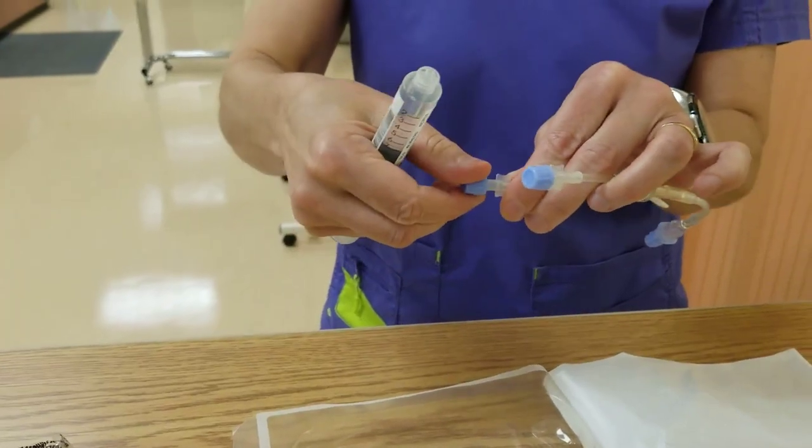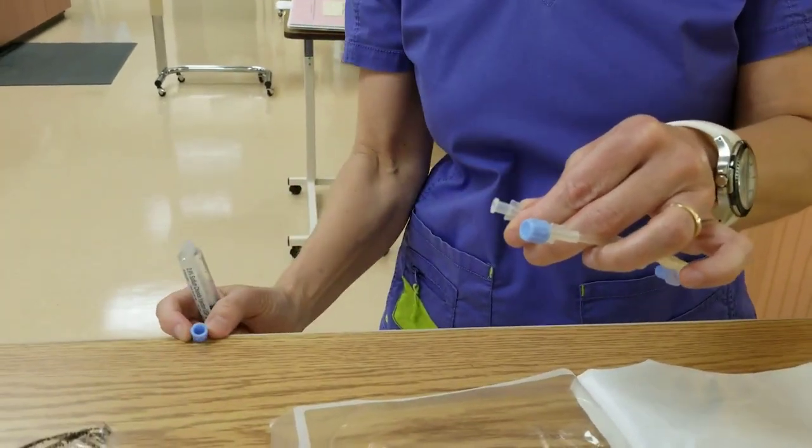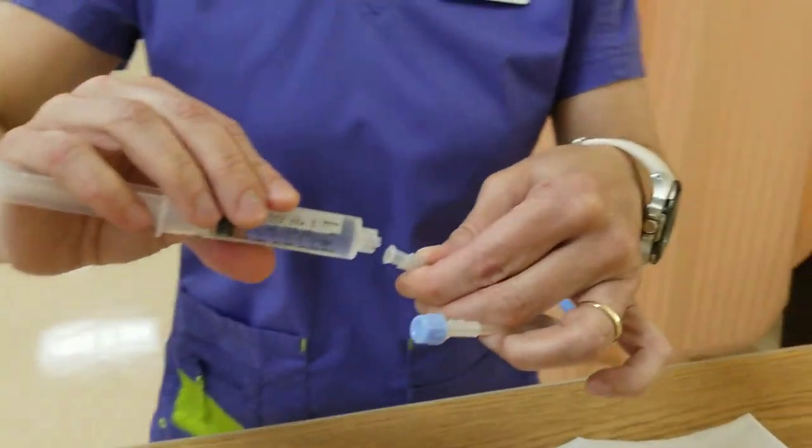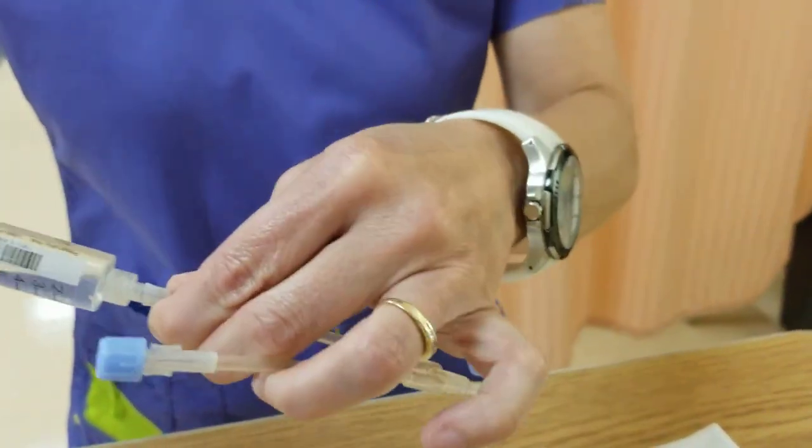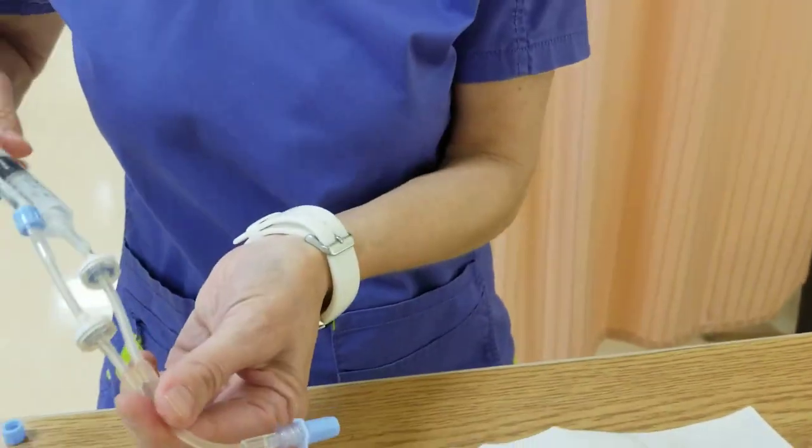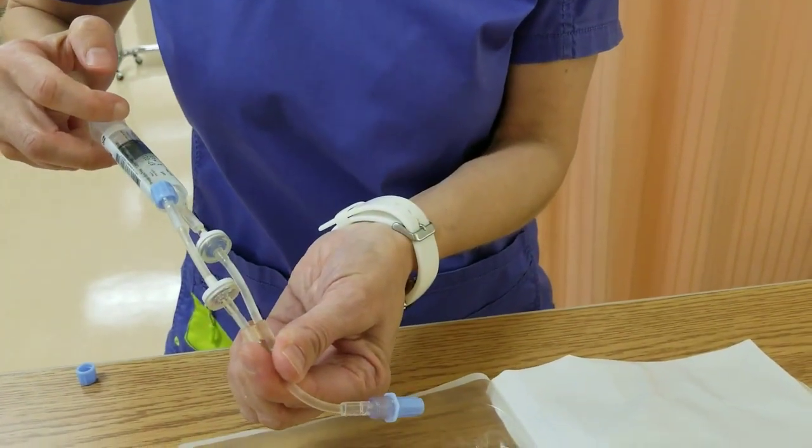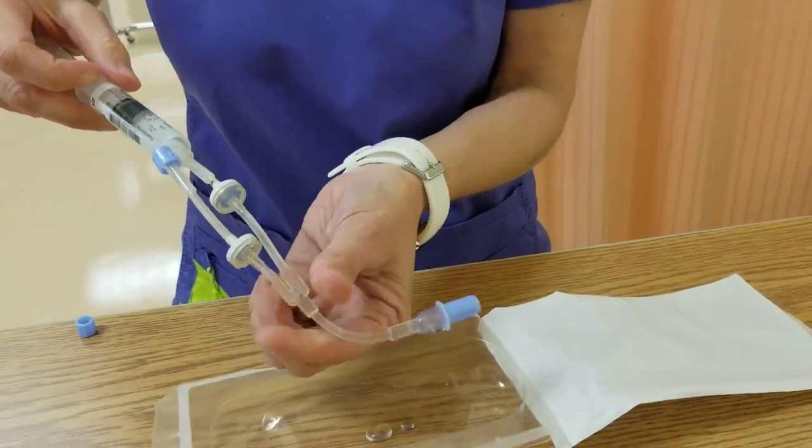I need to maintain sterility of the caps, so I'm going to just put it down there. I don't even need an alcohol swab because it's a lure attachment. And then I'll just flush it. And to me, this is quite handy to have this right here.